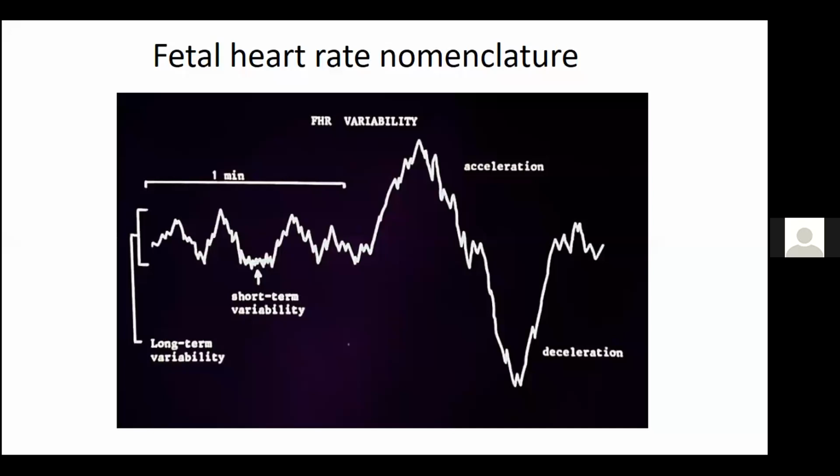Then, with rapid eye movement sleep, it is more like the baby is now awake, and there is a difference between each heartbeat. One heartbeat will be 120, the other 130, the other 125, and back to 120. So the CTG will connect the dots, giving us the short-term variability we are talking about. It is very important that we know this is normal behavior. For every CTG that you do over 50 minutes, you must expect a flat portion where the baby was in quiet sleep, and a portion with good variability. That is normal and physiological, so it must be expected in every trace that you do.